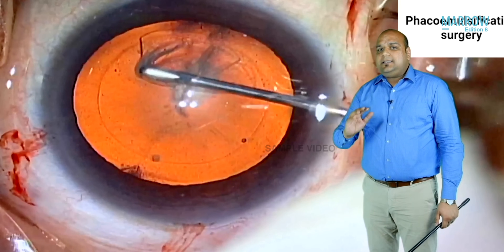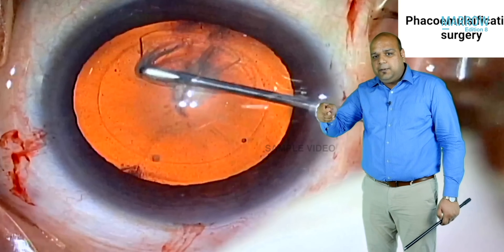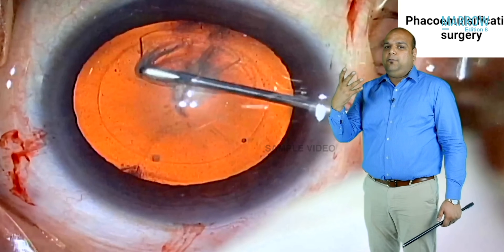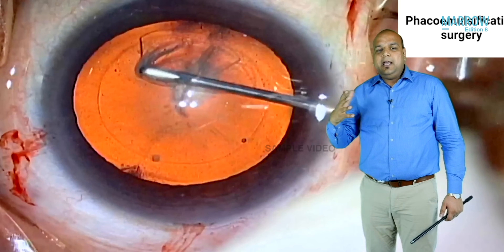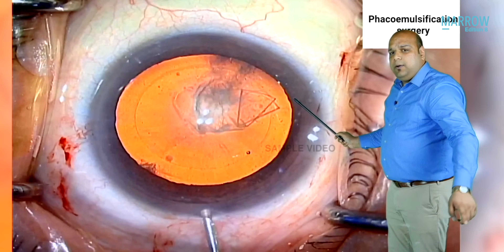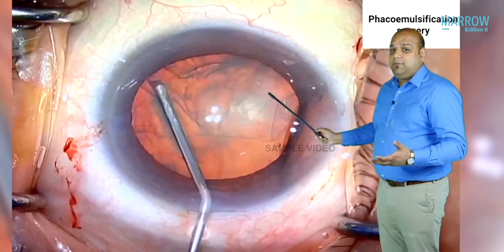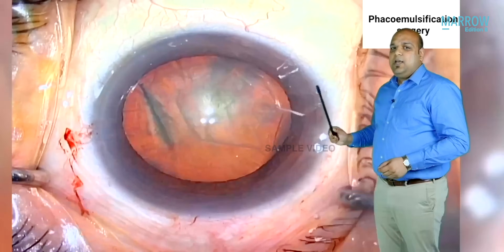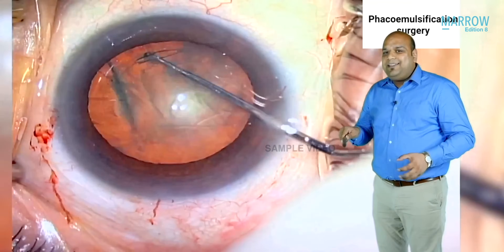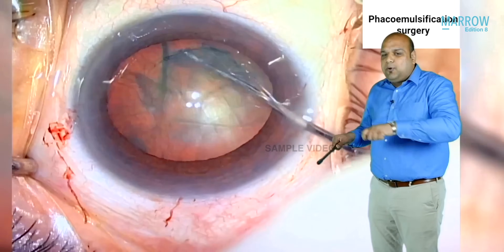This surgeon performs the capsulorhexis without staining the anterior capsule. Some surgeons stain it with trypan blue dye to see a blue surface and make the step slightly easier. This surgeon is experienced and performs it against the fundal red reflex — the orangish or reddish glow visible through the eye. Next, a cannula is inserted below the anterior capsule to inject fluid, performing hydrodissection — separation of the cortex from the capsule — allowing free rotation of the nucleus within the capsular bag.